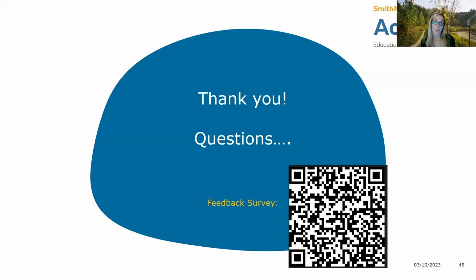Yeah, so as you saw in one of my case studies, I actually used a combination of both. You can either use all Curlix or you can use all black foam, which is your typical black foam that you see in negative pressure systems. That's not new. Their systems have been using the black foam for quite some time now, even their one back in 2015. So the black foam has definitely been around for a very long time. You can either use just the Curlix, just the black, or a combination of both.